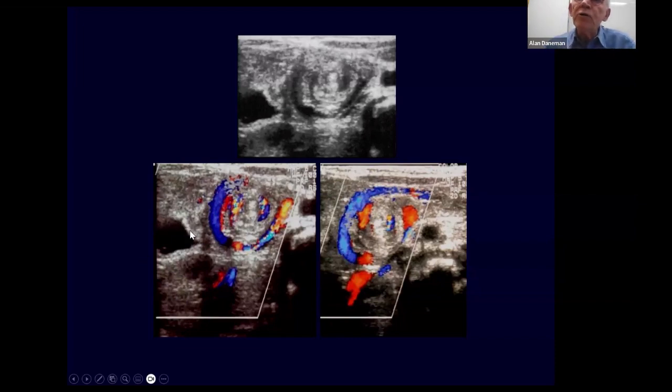So you've got the obstruction in the region of the duodenum. It comes to the beak that you see on the upper GI, and then you get the volvulus, so well shown and very easy to see on ultrasound, because this volvulus is immediately deep to the anterior abdominal wall. You don't have to go searching for it. It's usually in the midline, or sometimes to the right, or sometimes to the left of the midline, but it's quite easily visible.